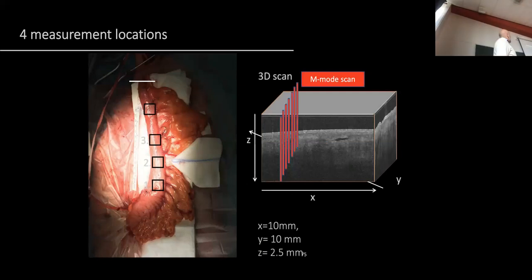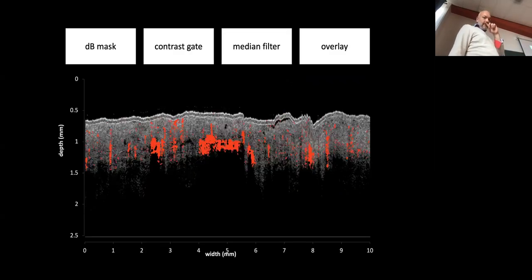Yes. And we created again what we call a perfusion scan with OCT. You could do that, for example, using a Doppler shift approach. But in this case, we did something similar to a speckle camera. We looked at changes in speckle behavior within the OCT data set. That's something Dirk has been working on for quite a while. And it helps us really study tiny microvessels in an environment like this much faster than we regularly did with the Doppler approach. And you get these types of images.